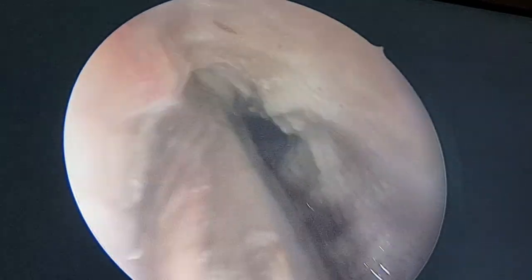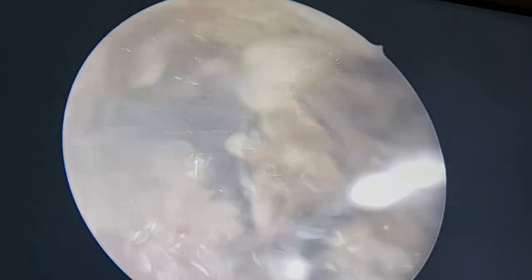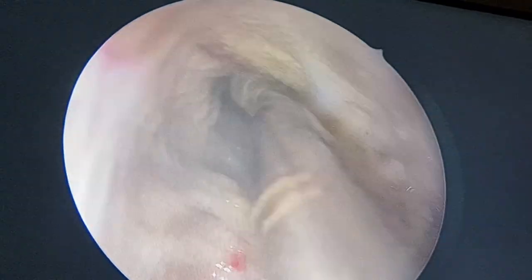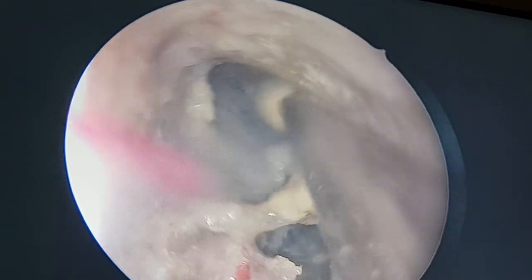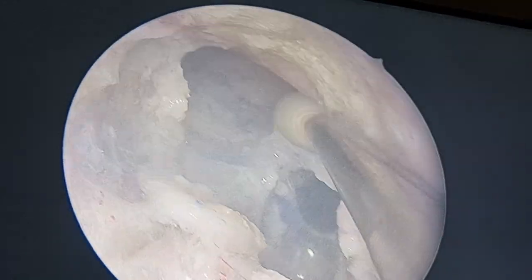See, my skin is coming. I am coming to the anterior skin now. See, you are walking anteriorly, there is nothing harmful there. No challenge there. As long as you are drilling anteriorly, there is no challenge. I cannot do this without the help of Medtronic. The state of the art drill. This is simply amazing. And we have done thousands of such procedures with this drill for very long.